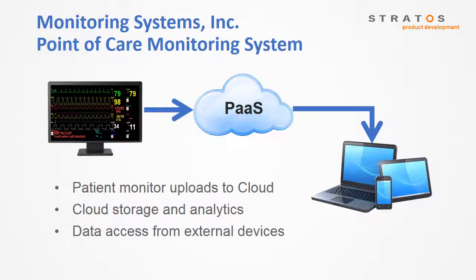The cloud service provider will provide the software APIs as well as the software and hardware infrastructure. Monitoring Systems, Inc. is responsible for developing the monitor-to-cloud and cloud-to-device interfaces and the mobile apps, for integrating the system, and for supporting the system after deployment. You may want to pause here to think about some of the challenges this system may face. And now let's continue and see what happens with the new system.